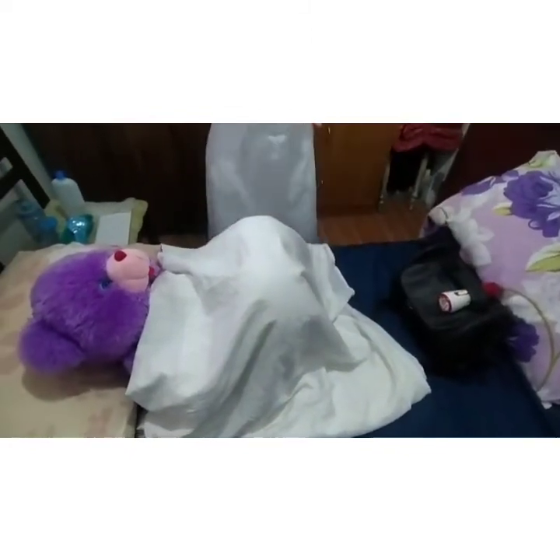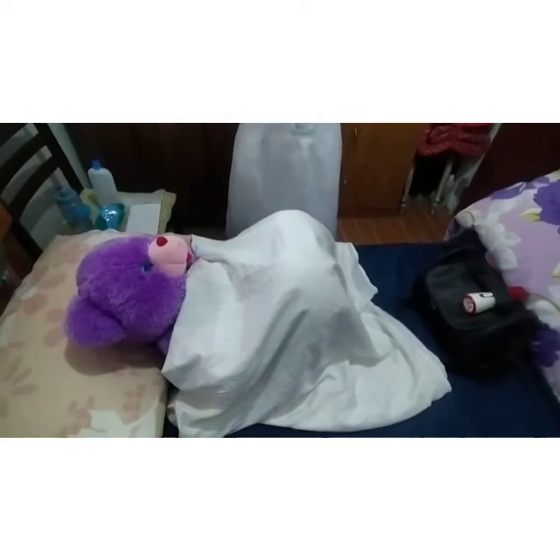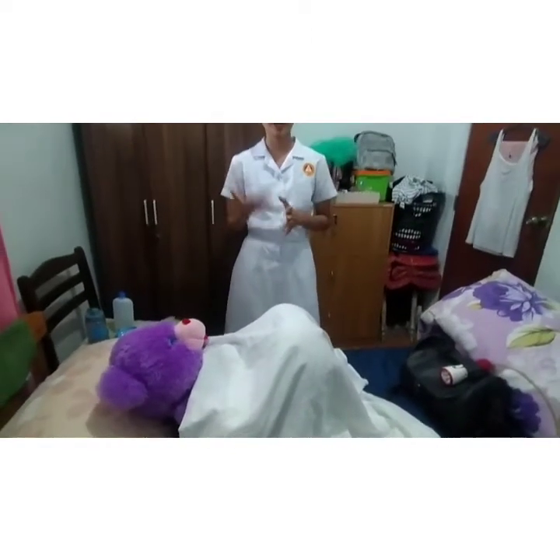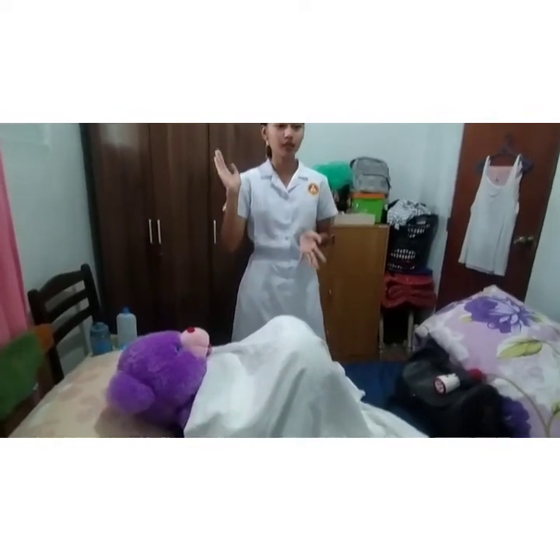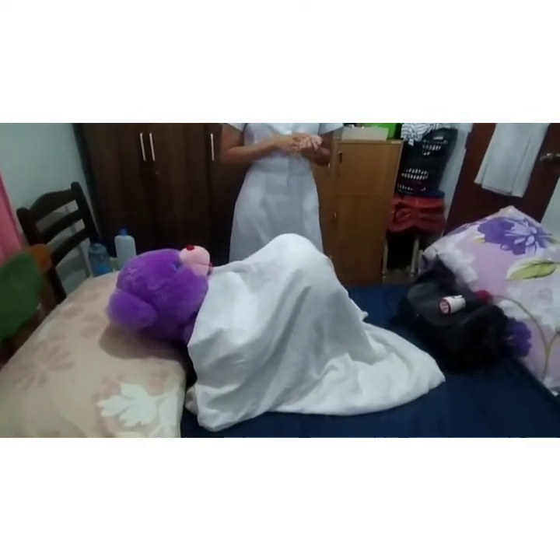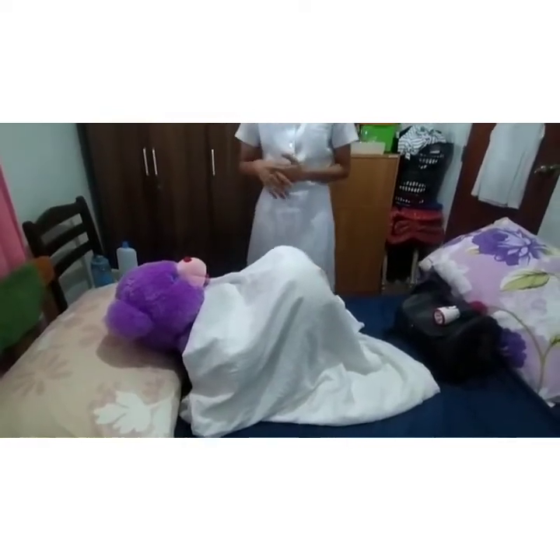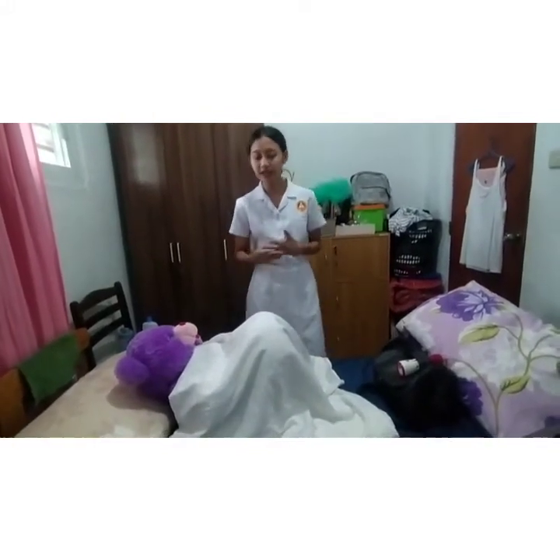Try to switch it on and off. Always handle equipment with dry hands to avoid electrification. Check the physician's order for the area to be treated and the duration of the therapy.